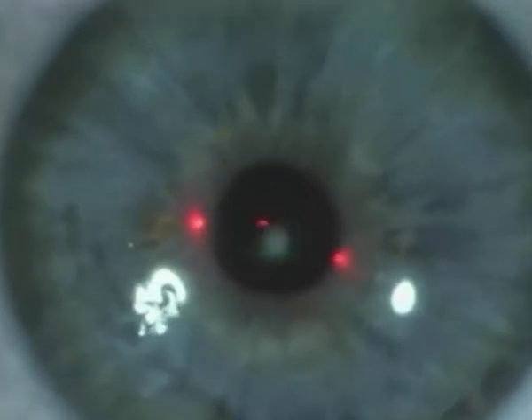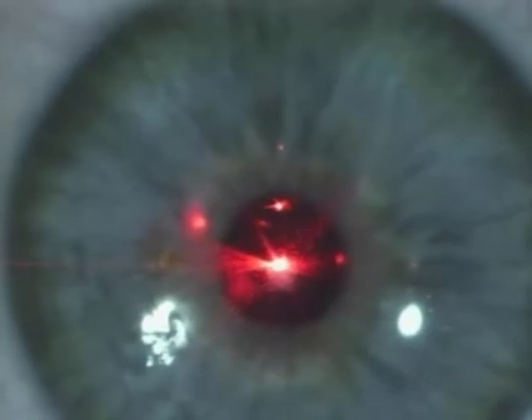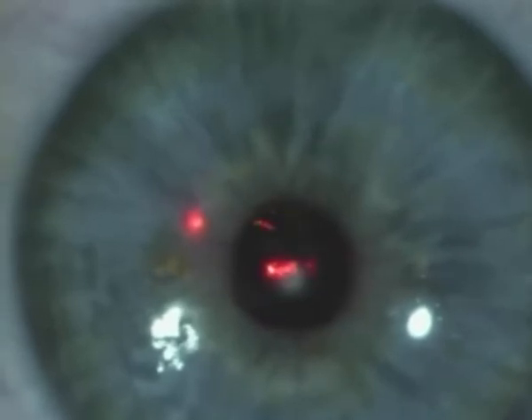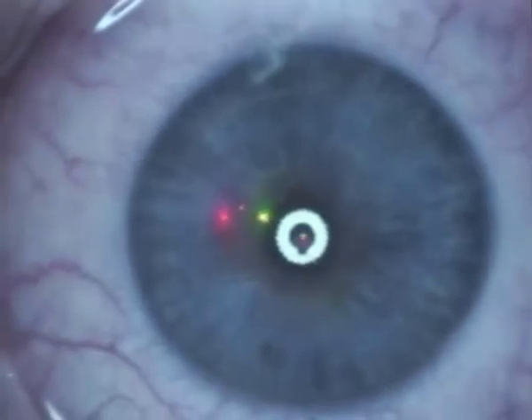Wavefront guided treatments are based on the center of the entrance pupil, and therefore they really aren't necessarily good to be performed in eyes that have a large angle kappa. Vertex centration of the refractive error correction is by far the best compromise.